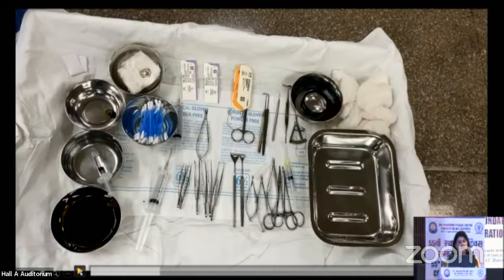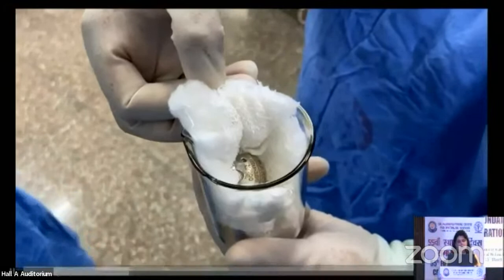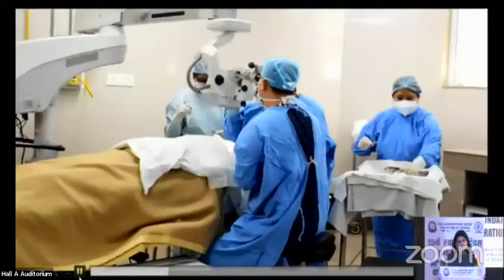Now, moving on to the actual steps of the surgery. So here again, this is to show you the dummy plaque. As you can see, this is a notched plaque. What do we mean by a notched plaque? Because the tumor is located quite posteriorly, it has a little notch to allow for the curvature of the optic nerve. So here you can see the steps of the surgery. First clean and drape, and then of course begin with the surgery.